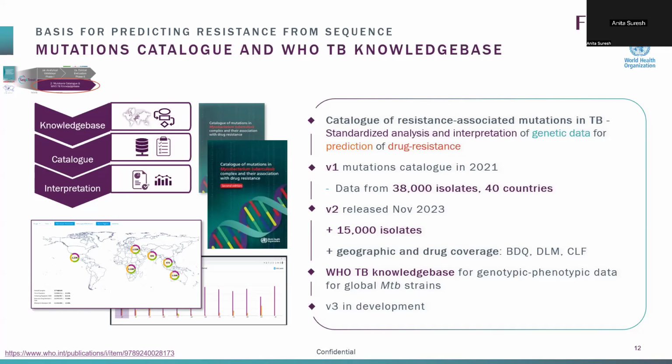Is there a standardized list? As many people have been publishing, there are many databases that exist. How do we get to that one list of truth that is the master list or standard, saying these are the mutations, these are the targets that one should be evaluating for, knowing that this list should get updated over time as new resistance emerges in the field, as it will.